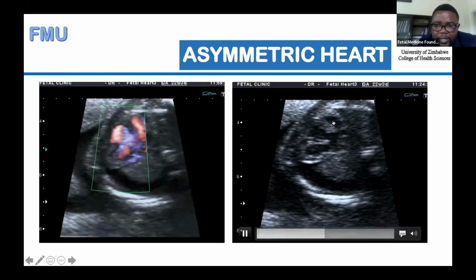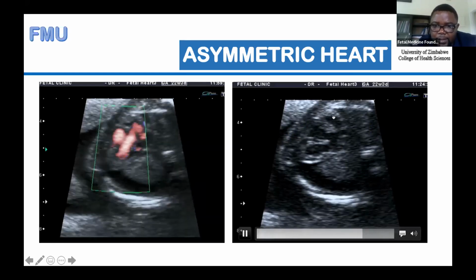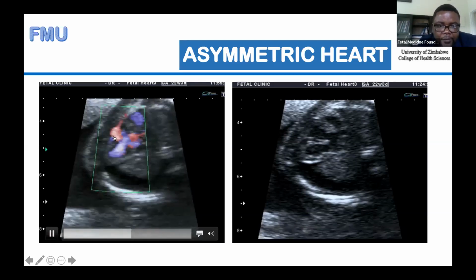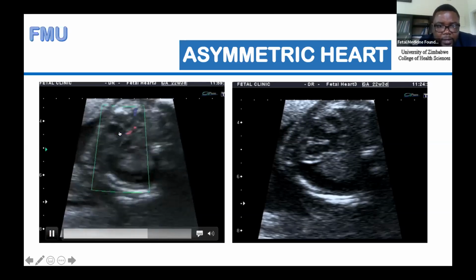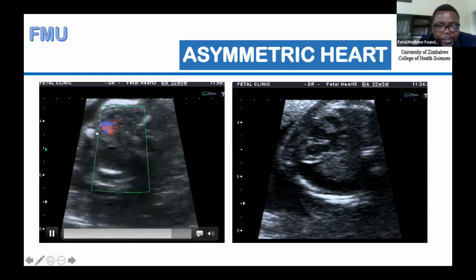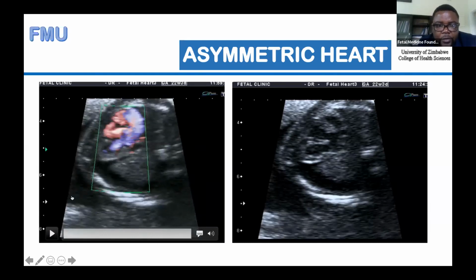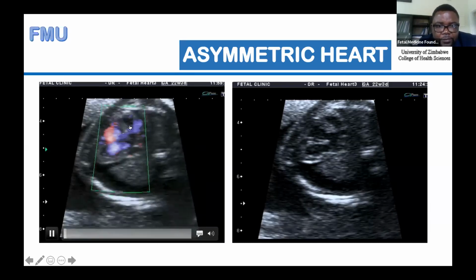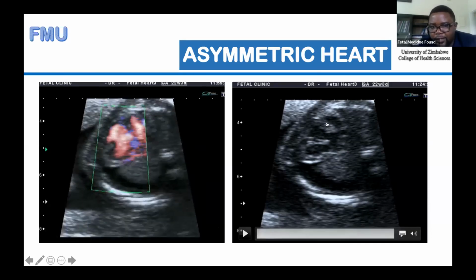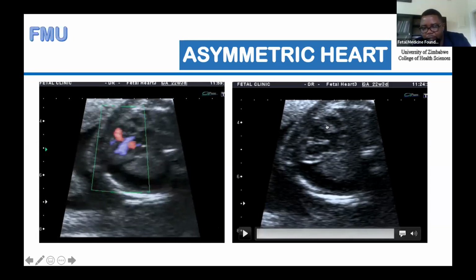This baby has a complex cardiac defect. We don't know whether the baby had three chambers, as you can see there, but this was the feeling of it. What we could see is that there was a large ventricular septal defect here, and the left was filling nicely, but the right wasn't filling nicely. So we suspected tricuspid atresia because you can see there's a valve which is not opening the way it should. We ended up with a diagnosis that this is the atretic valve of the tricuspid. So this was a case of tricuspid atresia.